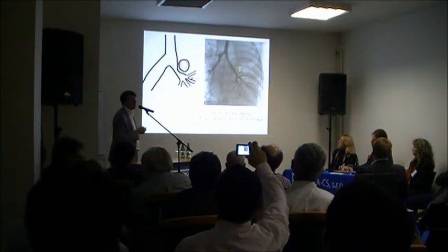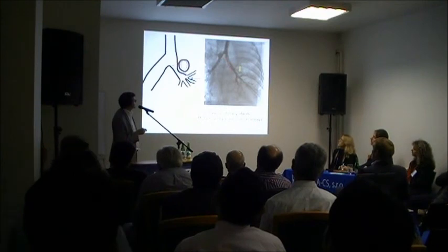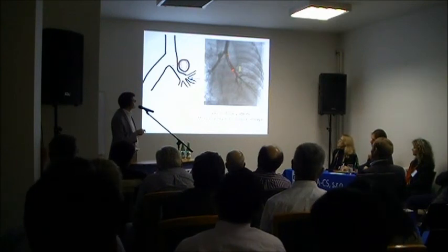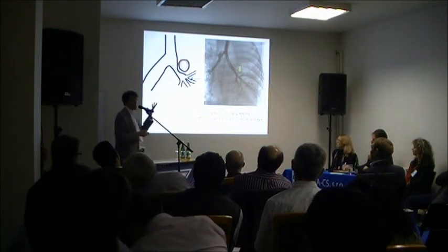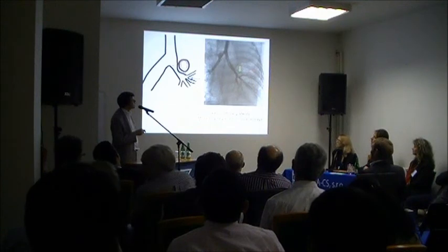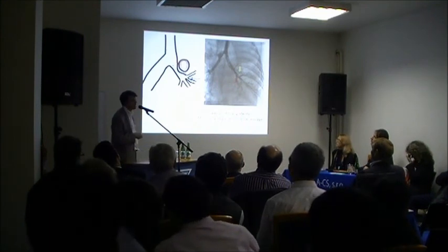Now people have spoken about the stents defragmenting and the gold tips migrating, and we have found in small babies, they don't cough them up, they just disappear down the lung somewhere. And you can see here a bronchogram. This is a new stent that was placed there. This is the remnants. This used to be up here, this used to be here, and these have now disappeared down the peripheral airway somewhere. We don't know where they are, we can't see them, so I'm not sure what the consequences of these things will be in time. They're very small, but they will certainly wedge in some of the peripheral airways. So if we keep repeating the stents every 4 months, we will end up with lots of potentially metal all over the place.